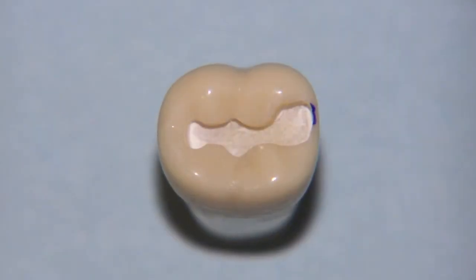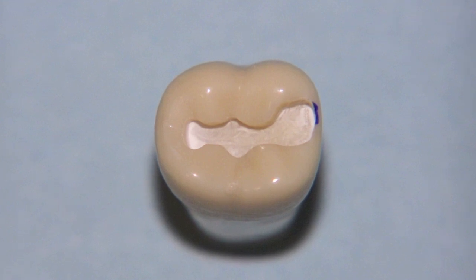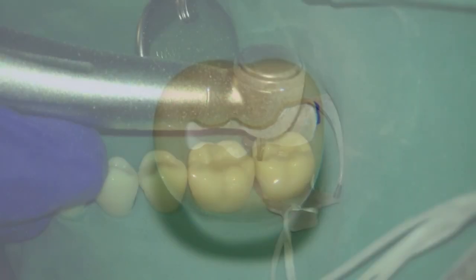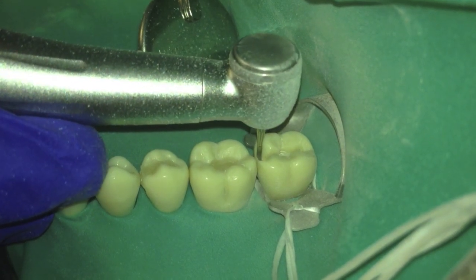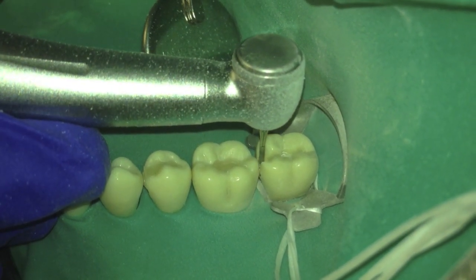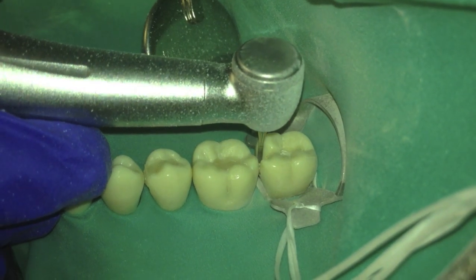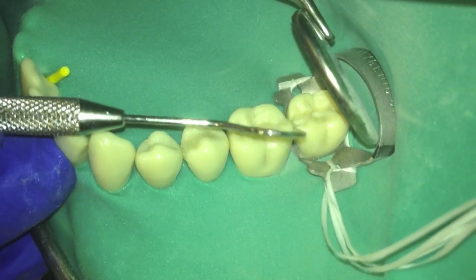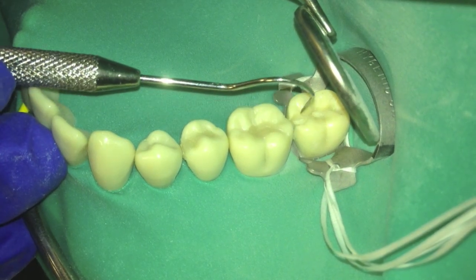At this point, the axial wall and gingival floor are prepared. The box is prepared by apically moving the bur in controlled buccolingual movements. The proximal cavo surfaces will have unsupported enamel.